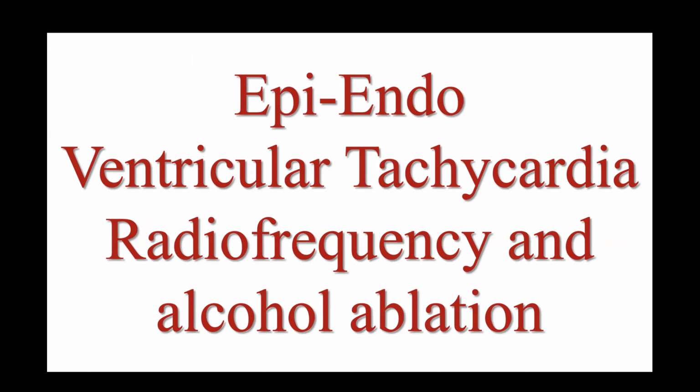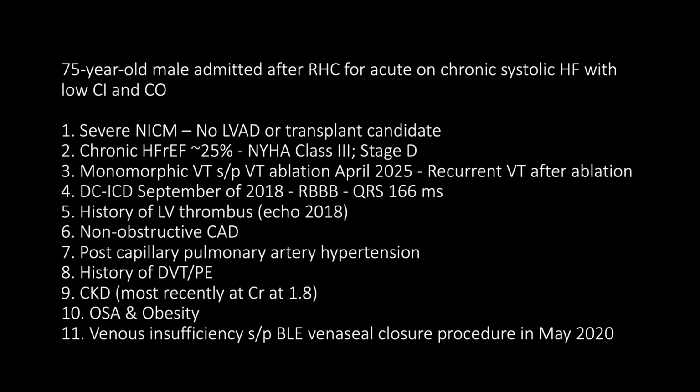Initially the plan was to do RF, only epi, and then alcohol, and then we ended up doing alcohol ablation. But to give you some perspective and the clinical correlation, this was a 75-year-old male admitted on the advanced heart failure service, where they see LVAD patients and transplant patients. They did a right heart cath, and he was decompensated, with low cardiac index and low cardiac output, and he was deemed not a candidate for LVAD or transplant. He had a reduced EF.